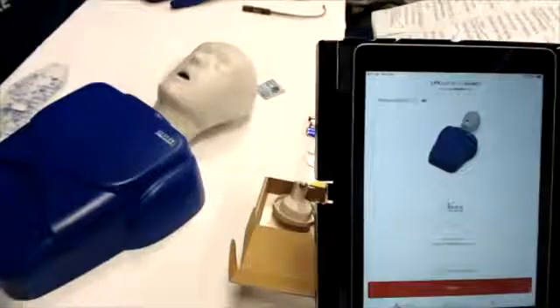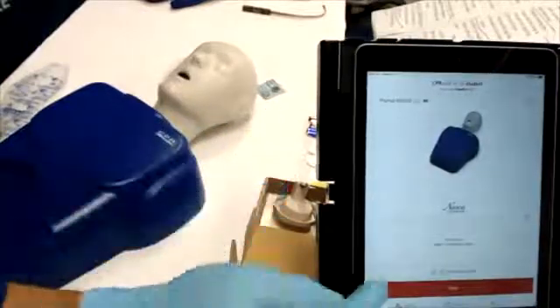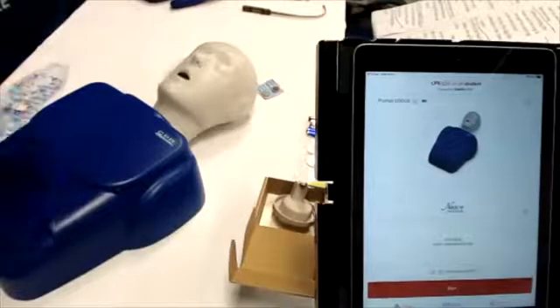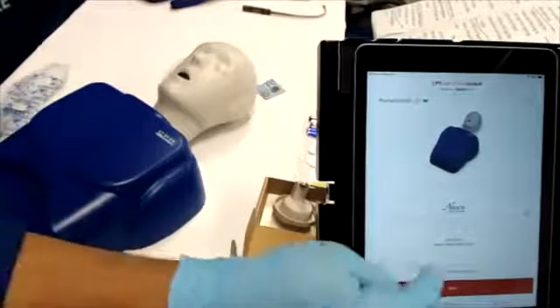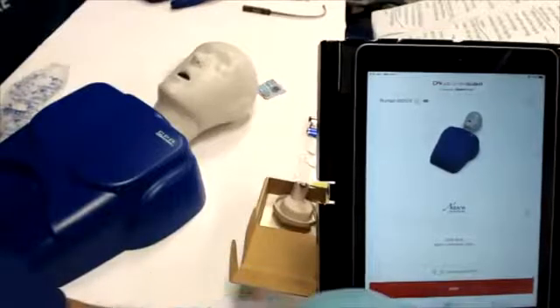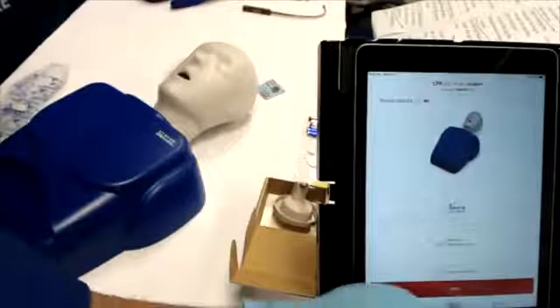Students will also need to select their CPR cycle, hands only, or compression and ventilation. The student application offers simple performance feedback on compression rate, depth, recoil, and hand placement.